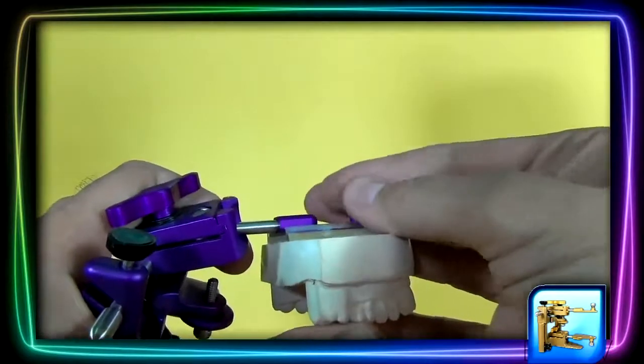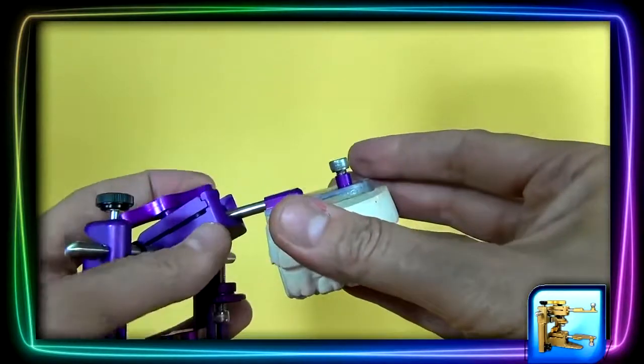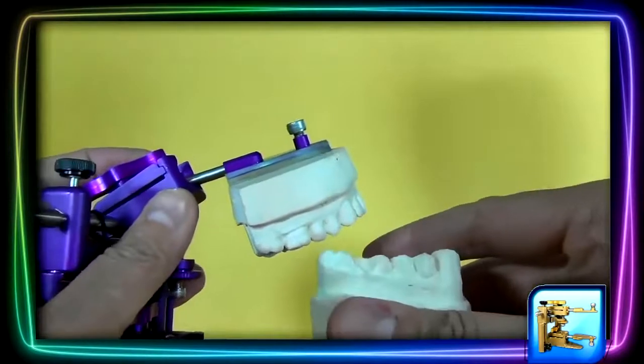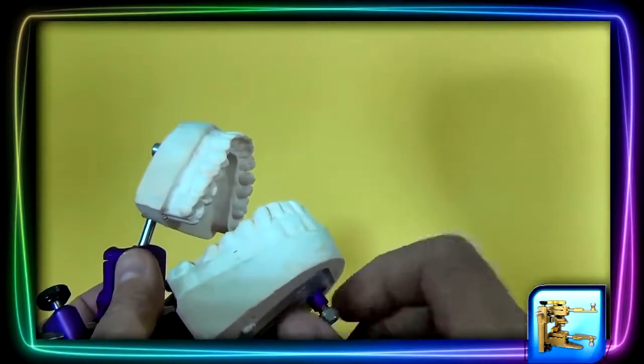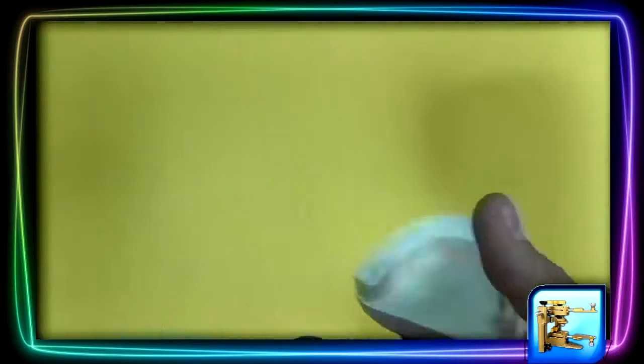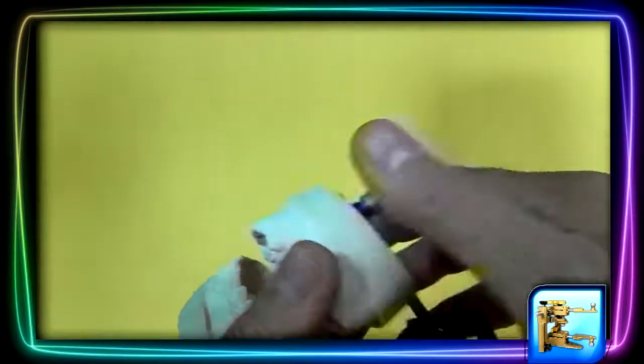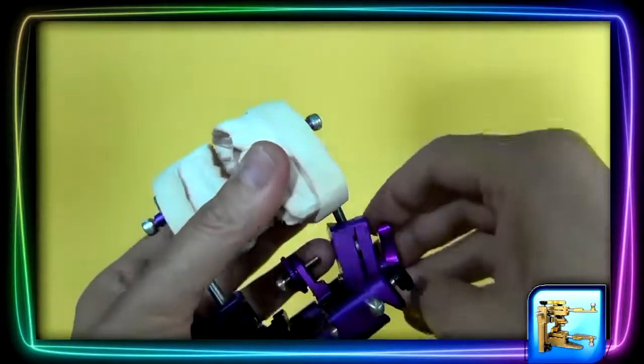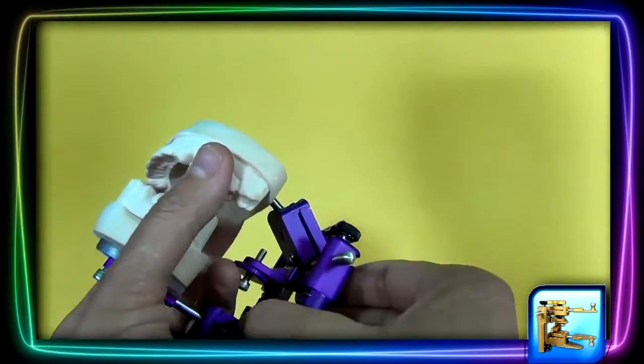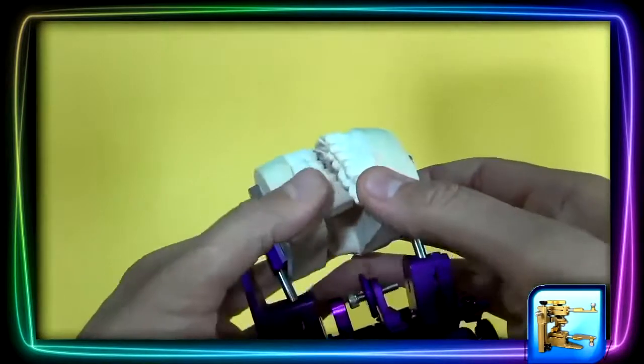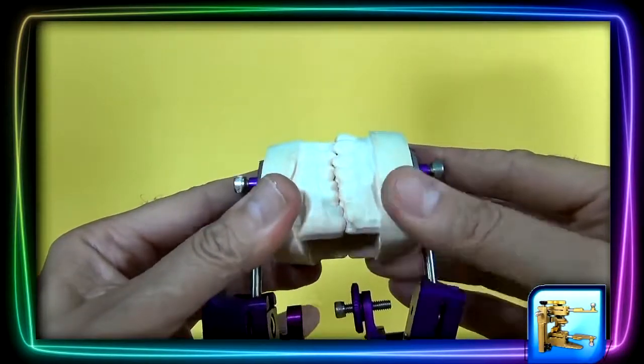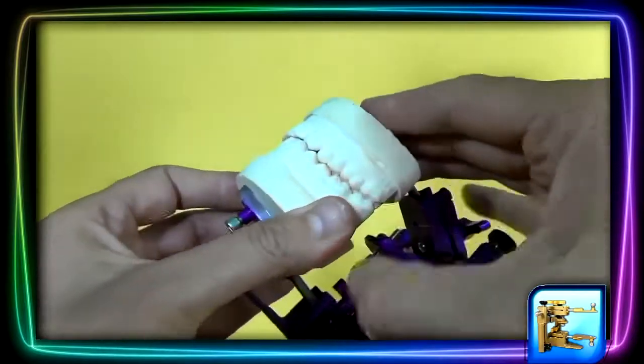And then tighten it securely. Take the lower model and do the same thing. Next, we're going to loosen all the knobs. This will make the articulator sloppy in your hands, but this will ensure that you can locate the right position without any effort, like so.